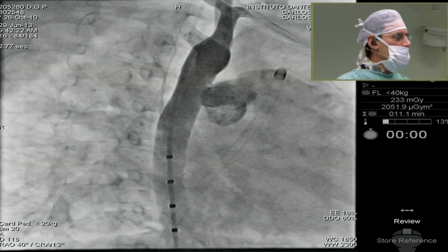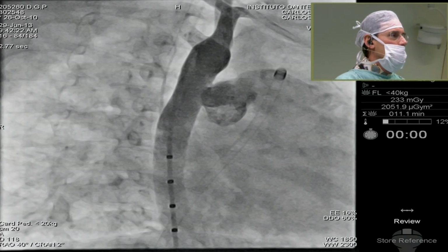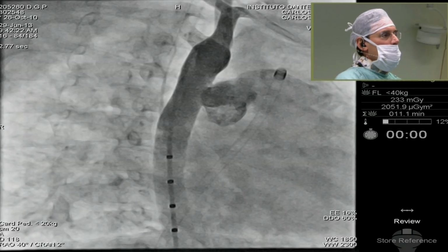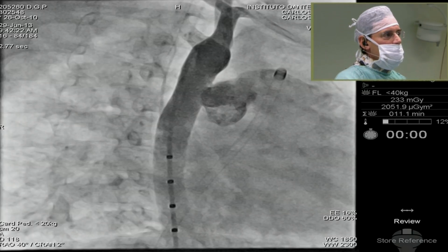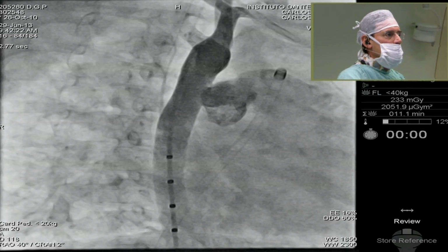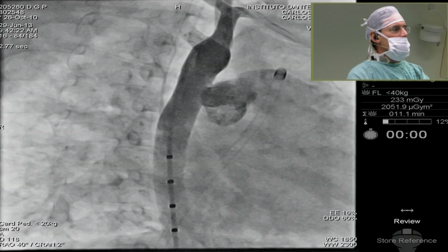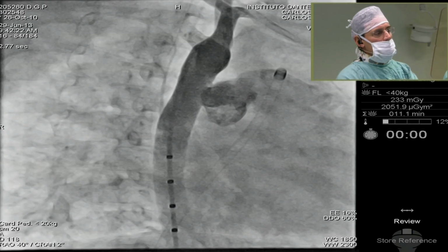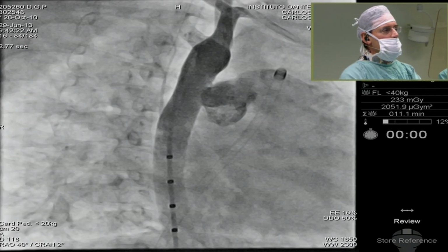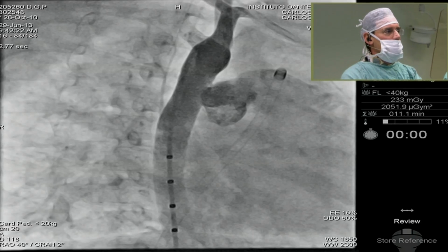As I said before, I don't have that much experience with this device yet, but based on Mazzini's experience on 45 patients at a median age of 2 years, none of the patients who had very large PDAs, about 16 patients, had hemolysis, even having this degree of residual shunt just 5 minutes after the procedure. So I don't think we're going to have hemolysis here. It does have fabric inside, the PET.